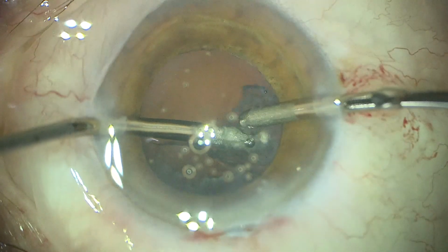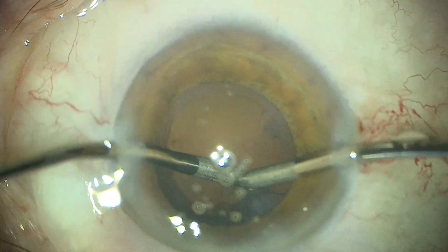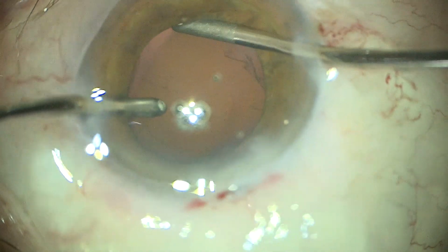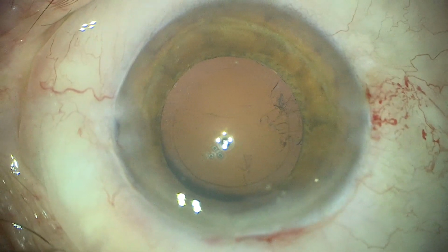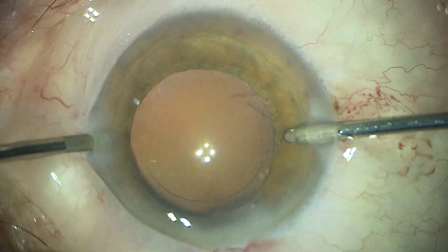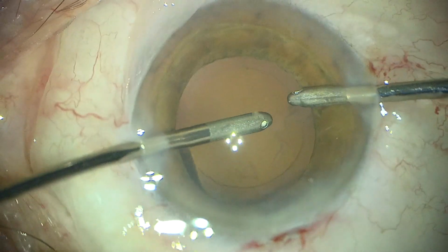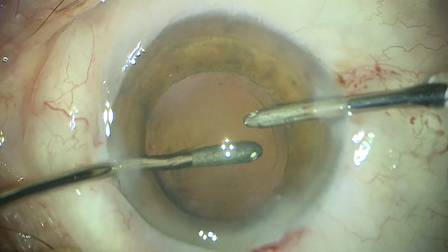The irrigation aspiration of the cortex is actually more dangerous for the PEX complications than the phacoemulsification itself. We must avoid at any price pulling the anterior capsule with the aspiration handpiece. So we try to use as much water as possible and less aspiration to release the cortex. If we pull a little bit of cortex, we use low vacuum, and only when we are in the center of the capsule, we use full vacuum, of course, with the opening superior.